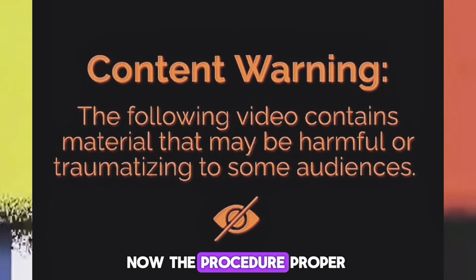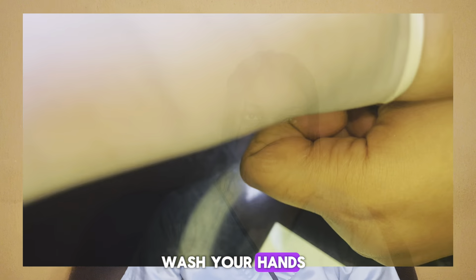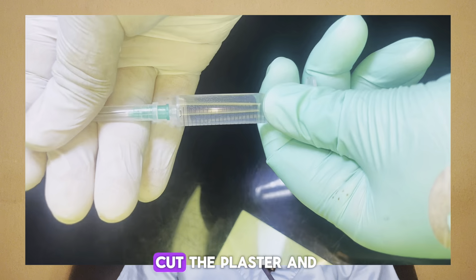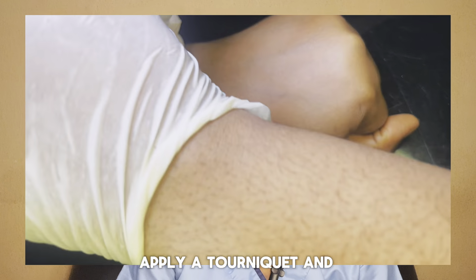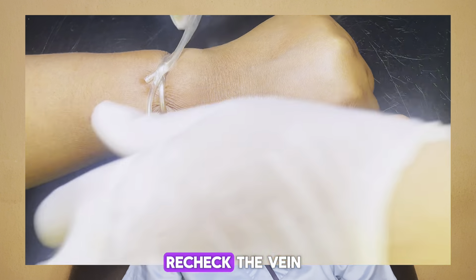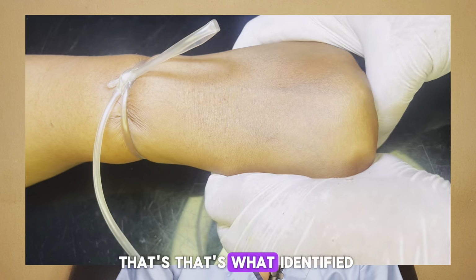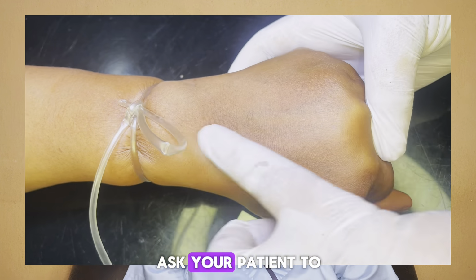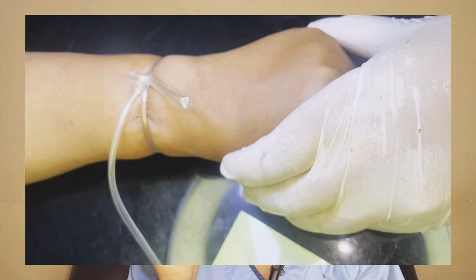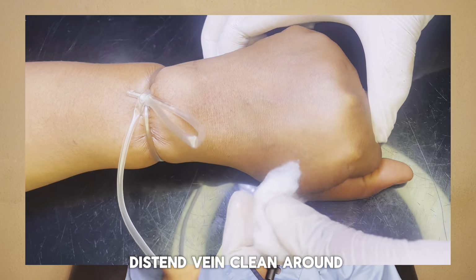Now, the procedure proper. First step, wash your hands and don your gloves. Draw 2 to 5 ml water for injection and set aside. Cut the plaster and also set aside. Apply a tourniquet and identify a suitable vein. Recheck the vein that you identified. Ask your patient to close and open fists in order to distend the vein.